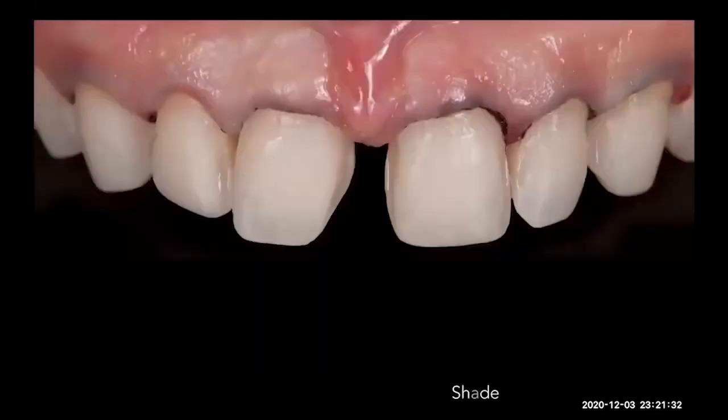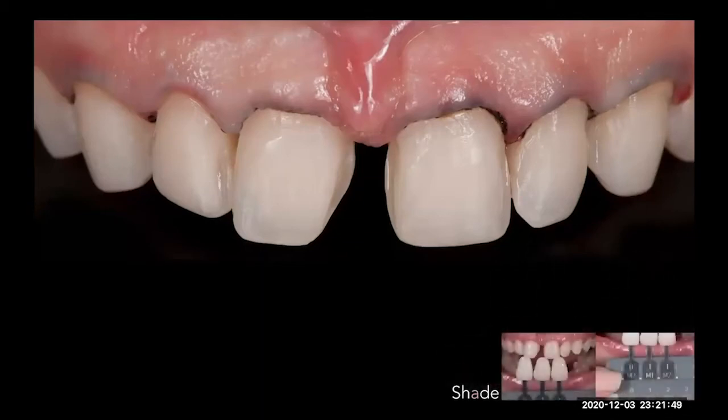And he did a nice preparation, going back to maybe the same level, a little bit back from the papilla, because that is the only way that you cover the connection between restoration and teeth. So he did a great job. Then he gave me the stump shade information that is really important when we use translucent materials.